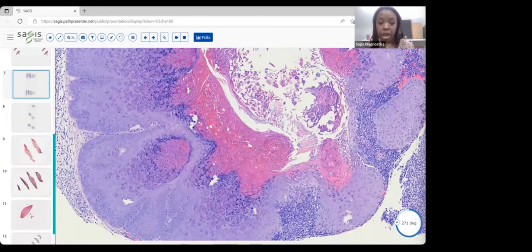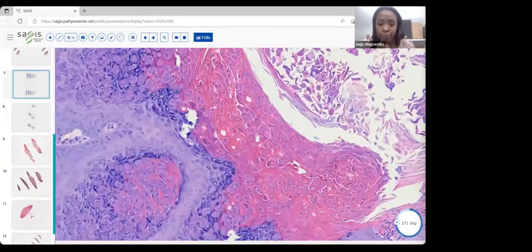Same kind of cell. But the keratinocytes here, they're huge because of the huge inclusions in them, but they're so similar to each other in a zone. Each one looks like the next one, looks like the next one, all right, in each zone. And then let's just go back again to just get an eyeful of it.